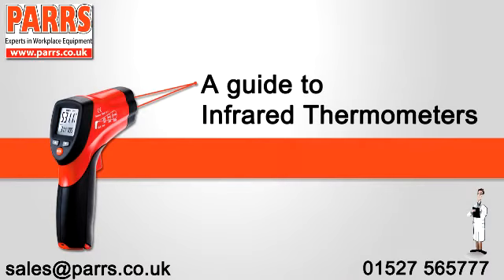Considerations when using infrared thermometers. It's not as simple as some suppliers would have you believe. It's not point, pull the trigger and read the measurement. Infrared thermometers are equipped with sophisticated optics that measure radiated heat.